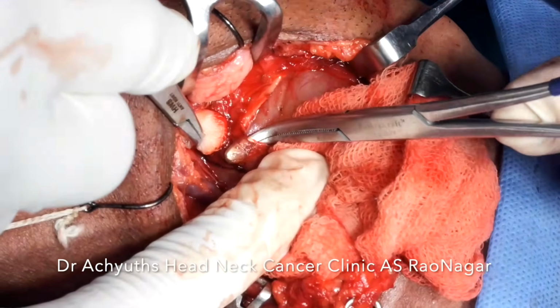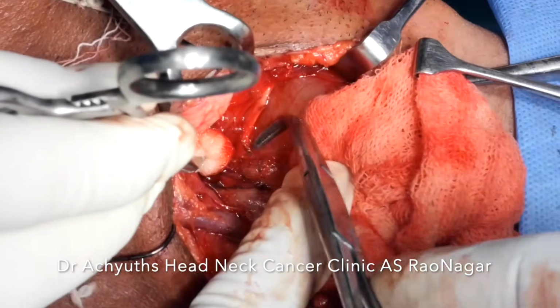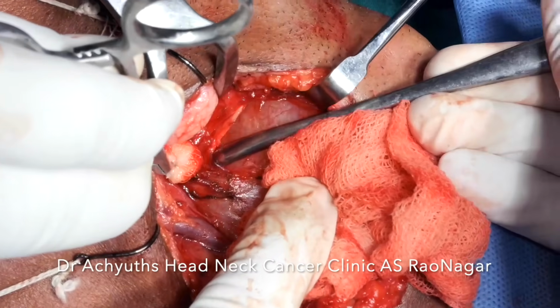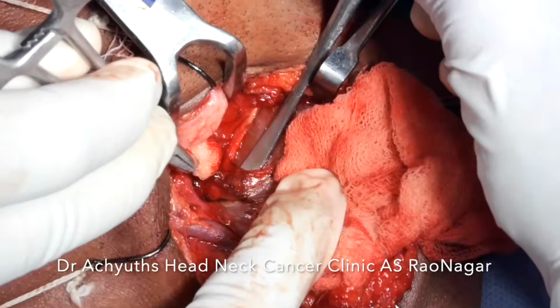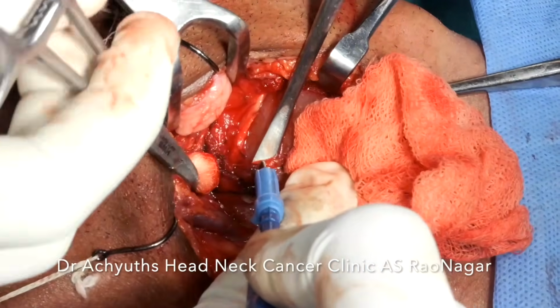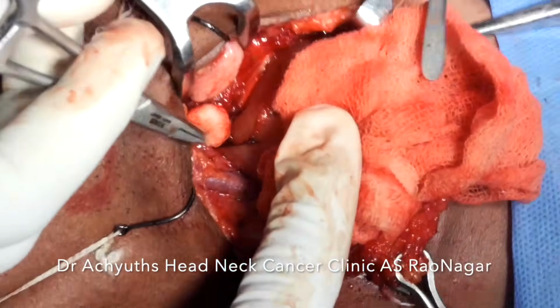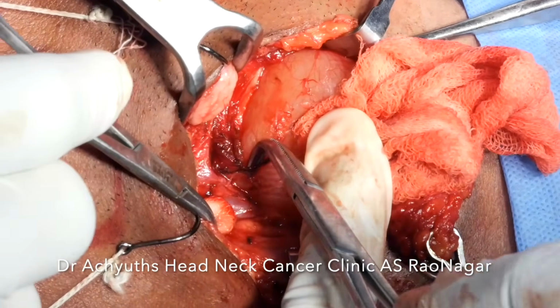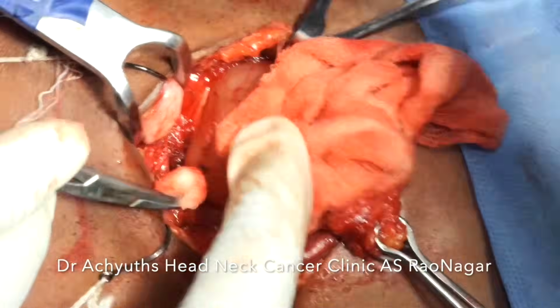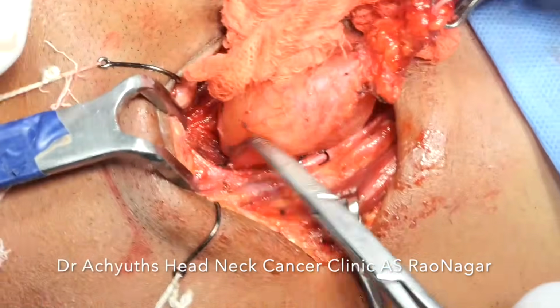Here it is little difficult to dissect the fascia. It is not easily dissectable like you do on the other sides of the cyst, because the periosteum is little thick and it is more adherently attached to the hyoid bone. So you will require little use of cautery and some pressure when you are using the elevator.